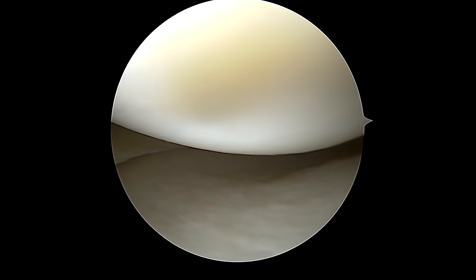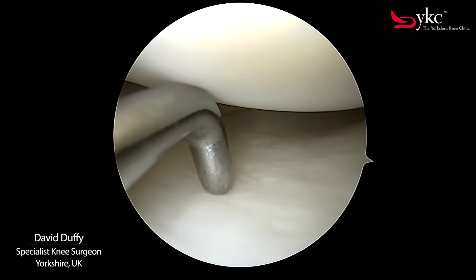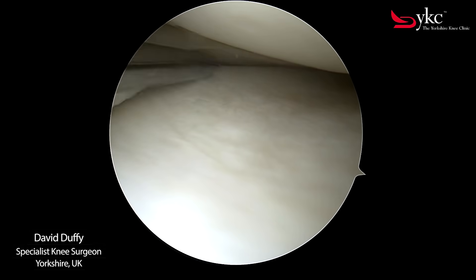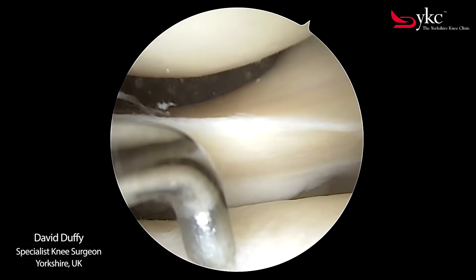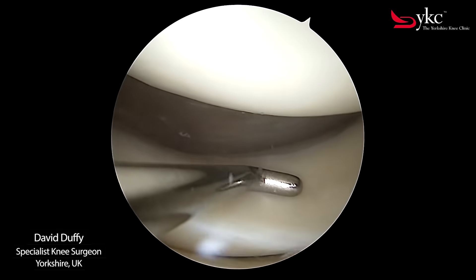Looking into the centre of the knee joint I can identify three surfaces: the articular cartilage on the femur, the tibia, and between the two is a semicircular structure called the meniscus. The meniscus is a type of cartilage that has two main functions — it helps spread a person's weight evenly across the joint whilst also providing some stability.